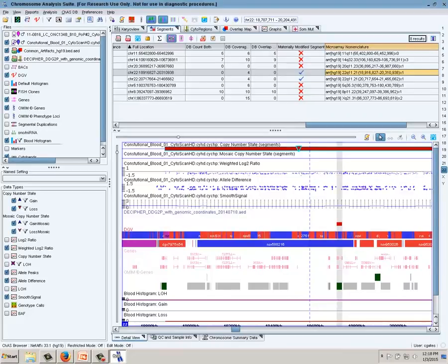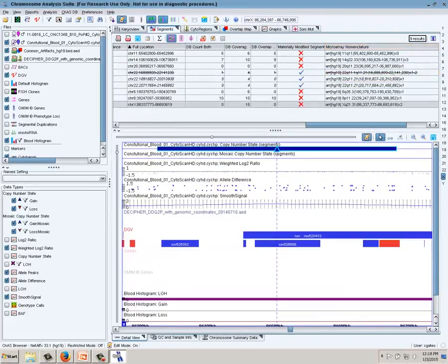So we've added the sample interpretation, and now we can publish samples to the database. I want to talk about two things just to keep in mind. You cannot publish in edit mode. Like we were in edit mode when we were deleting some of the segments and some of the mosaic segments and merging others.